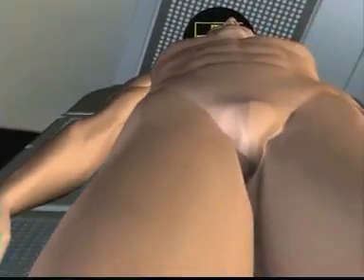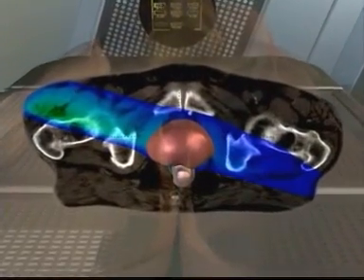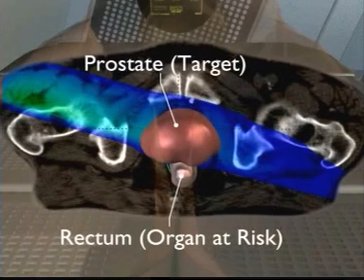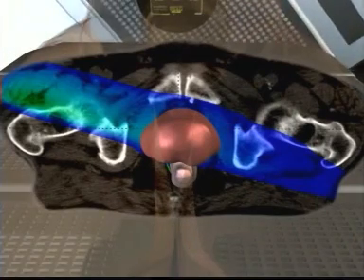Looking inside the patient shows us the dose contribution of this first field. The target volume and the organ at risk are clearly visible. The second field is delivered from a different direction.